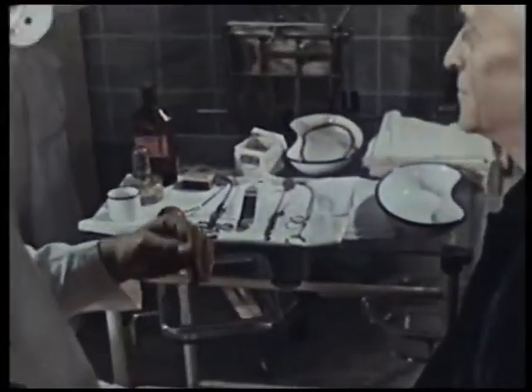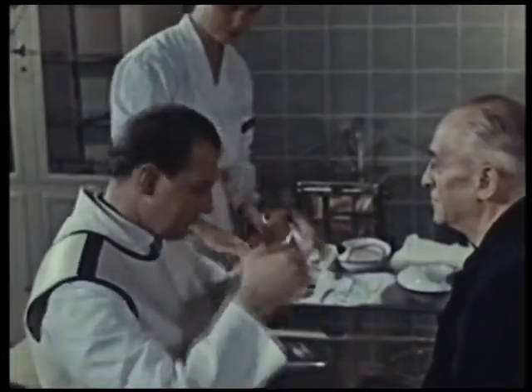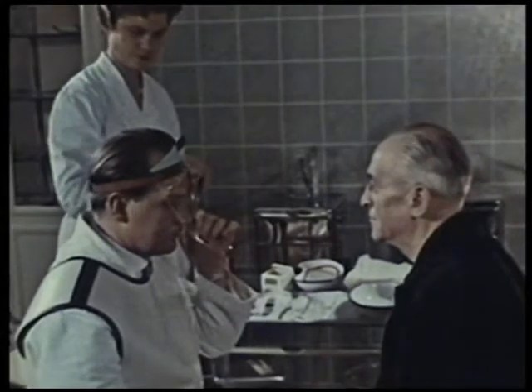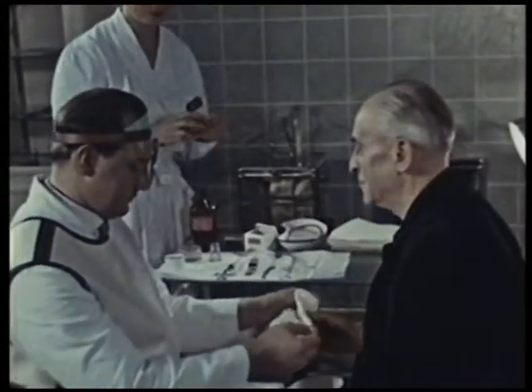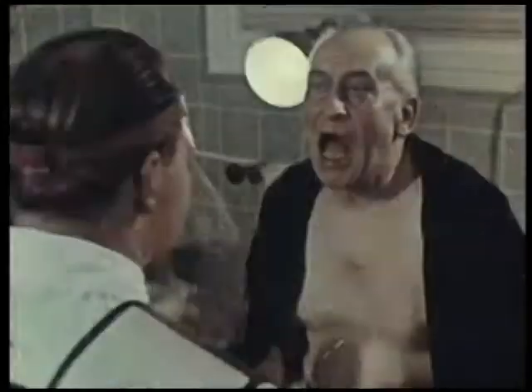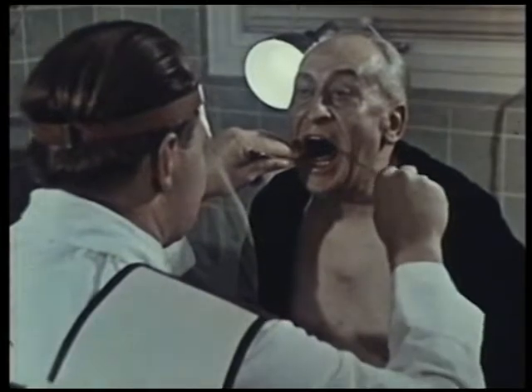Lorfan is used to prevent the respiratory depression which occurs when using a morphine-like compound alone. Good local anesthesia of the air passages is necessary for carrying out bronchography. A local anesthetic is first applied to the base of the tongue, the posterior wall of the pharynx, and the larynx.